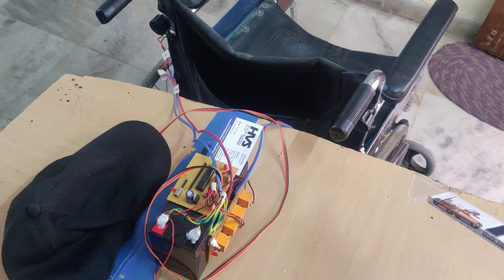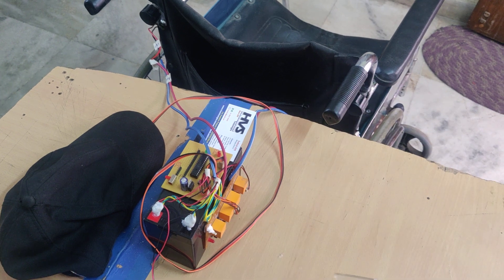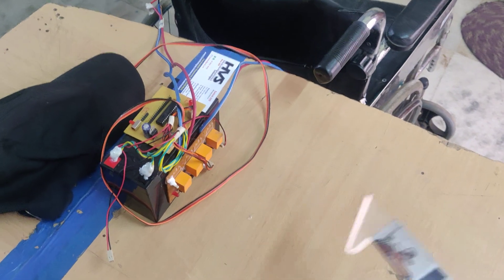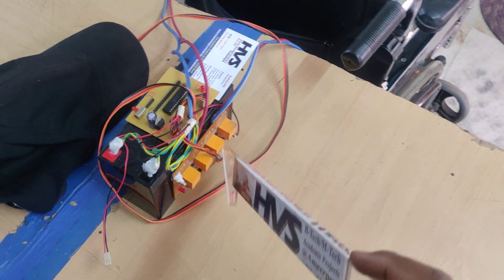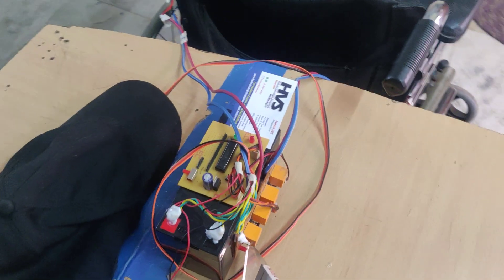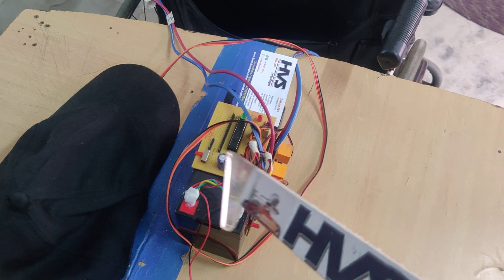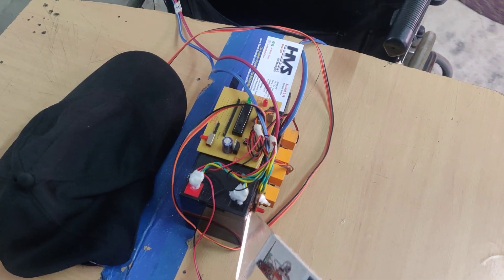For backward motion, both motors go backward. For right-side rotation, one motor goes backward while the other goes forward. In order to change the direction of the motors, we need to change the polarity of the motors, which is achieved with the help of this four-relay board connected to C0, C1, C2, and C3 pins of the PIC 16F72 microcontroller.